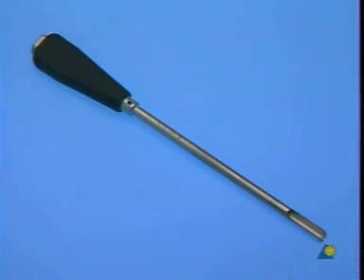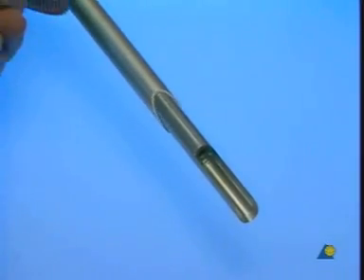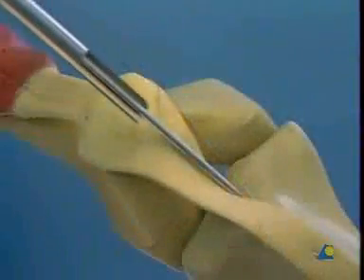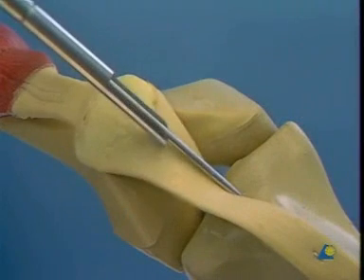After removal of the T-handle, the medulla is opened using the cannulated cutter. The tissue protector is placed over the cannulated cutter and pushed as far forward as possible, so that the sharp cutting edges of the instrument do not injure the soft tissue at the insertion site.